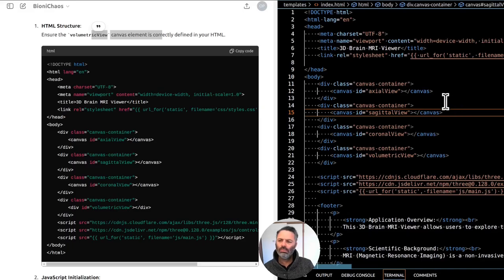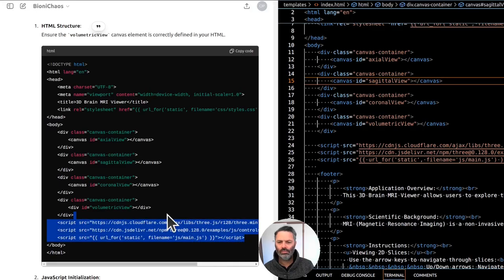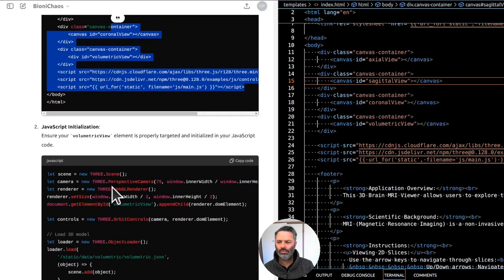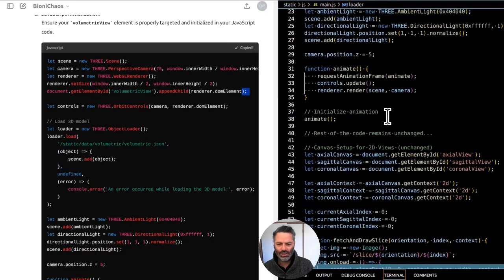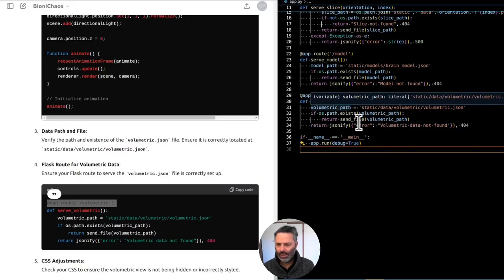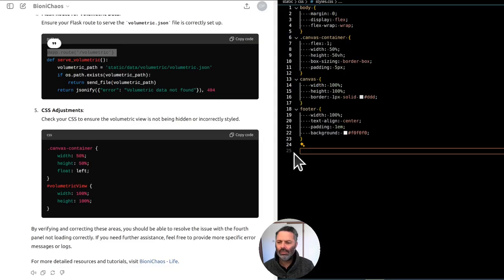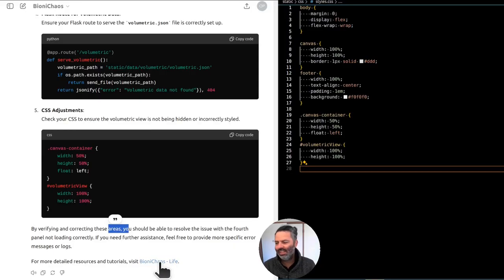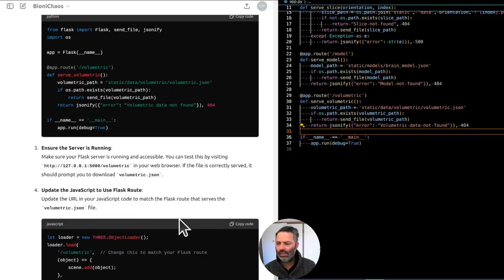The fourth panel in the setup corresponds to the volumetric view. Here are possible reasons and solutions. First: HTML structure — ensure the volumetric view canvas element is correctly defined in HTML. There were no significant changes in the HTML, it didn't actually change anything. There's an app.py volumetric route. That last sentence is totally out of whack — those are the instructions given to the custom GPT.